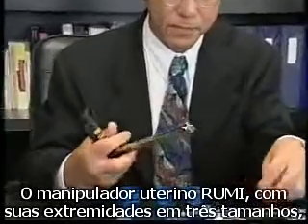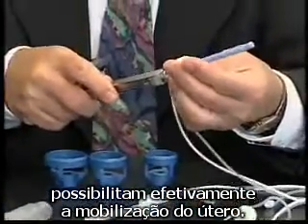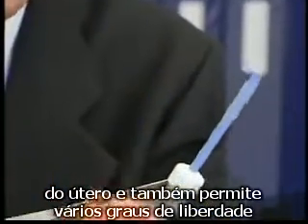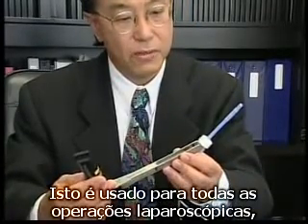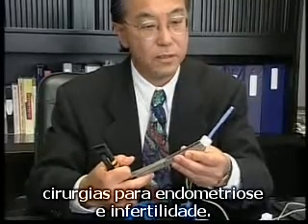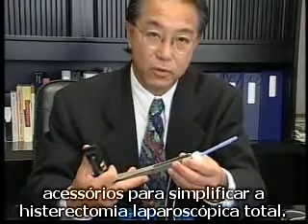The RUMI uterine manipulator, with its three tip sizes — namely 10, 8, and 6 centimeter depths — enables the mobilization of a uterus very effectively. This versatile uterine manipulator allows anteflexion and retroflexion of the uterus and also allows several degrees of freedom: one can push in, pull out, move to the right or move to the left of the uterine position. This is used for all our laparoscopic operations, not only hysterectomy, and is particularly useful for endometriosis surgery and infertility surgery. What we did was to add on to this existing system attachments for simplifying total laparoscopic hysterectomy.